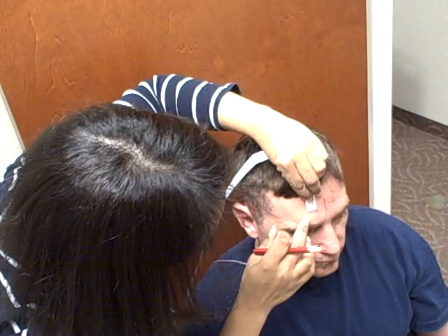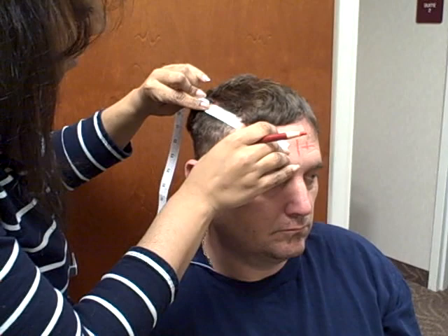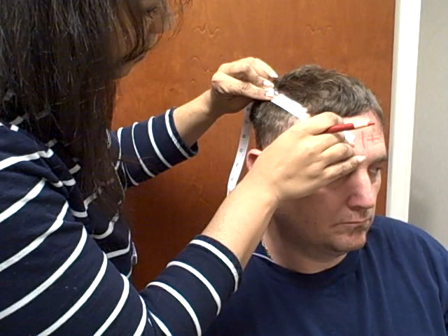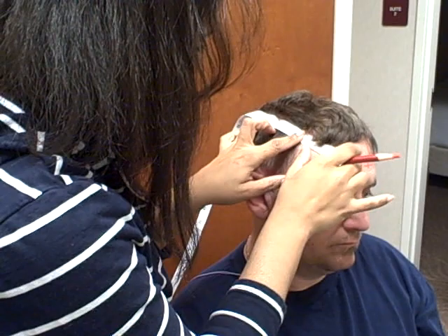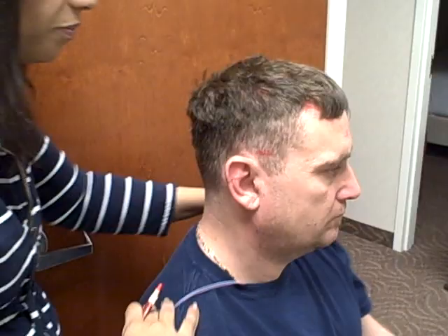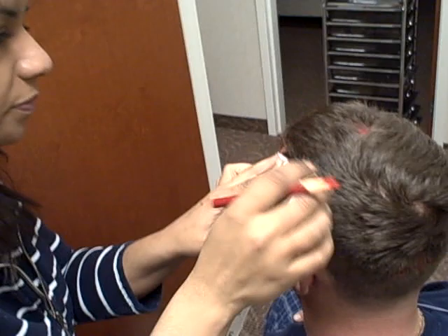In order to get your F electrodes, it's 50%. You're going to come and measure right along the line that you carried out, and stop where you made your C4 mark. That comes out to 15 centimeters, and you take 50% of that and mark for your F electrodes. I'm going to continue around and make the same measurement on this side, coming halfway and making my marks.